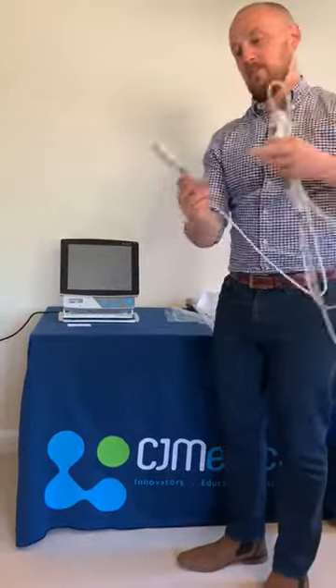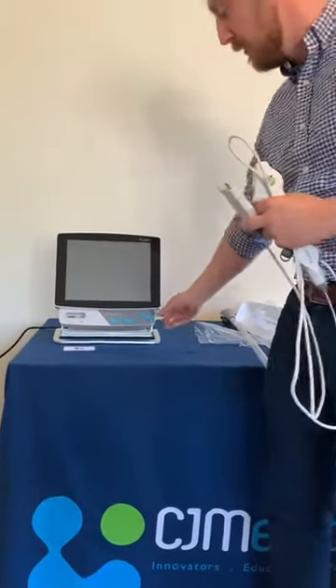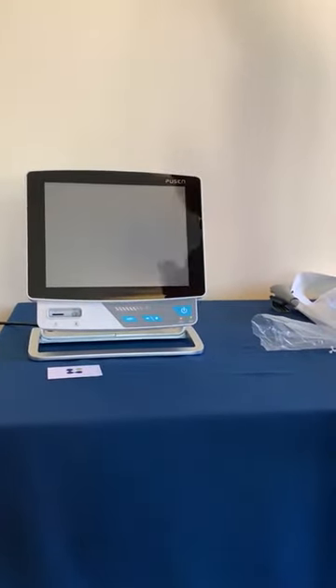Once you've opened the device, now it's time to plug it into the monitor. The monitor is also plugged into the mains but does run off battery as well. So we can turn our monitor on and wait for the blue screen to come, which is our home and standby screen.